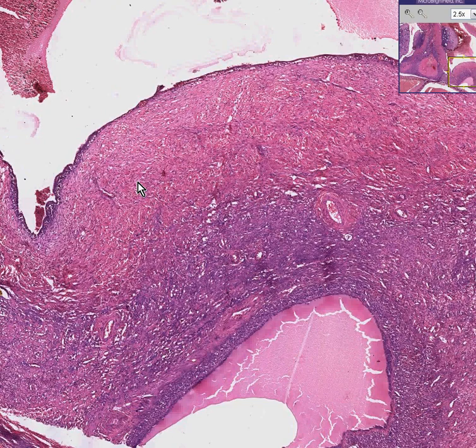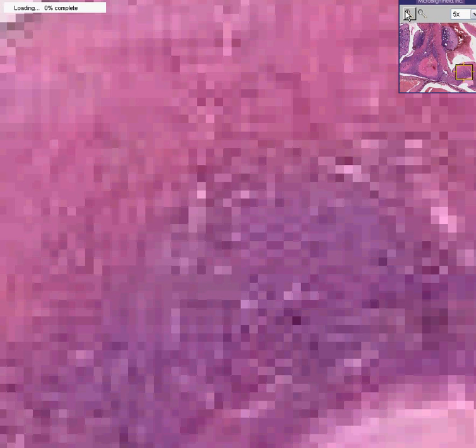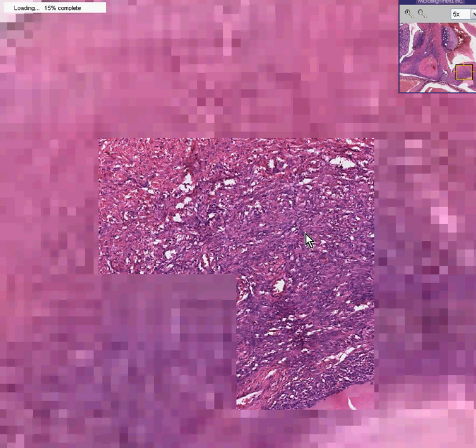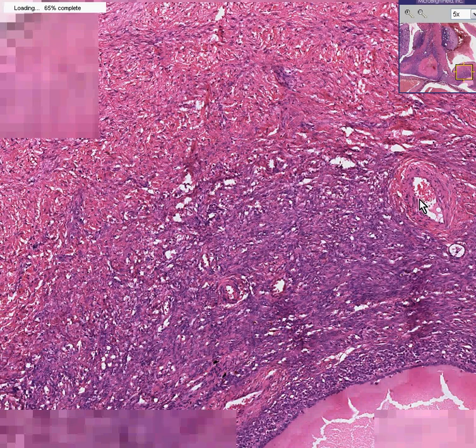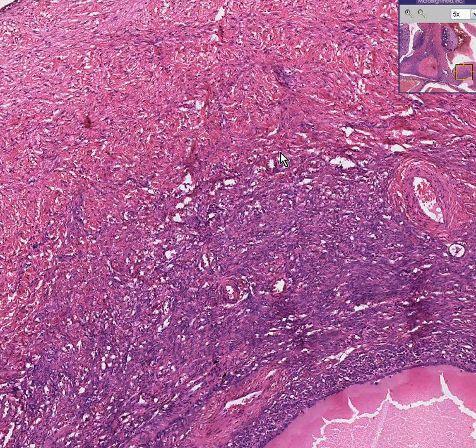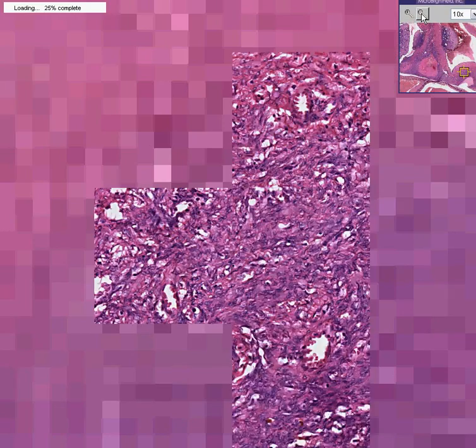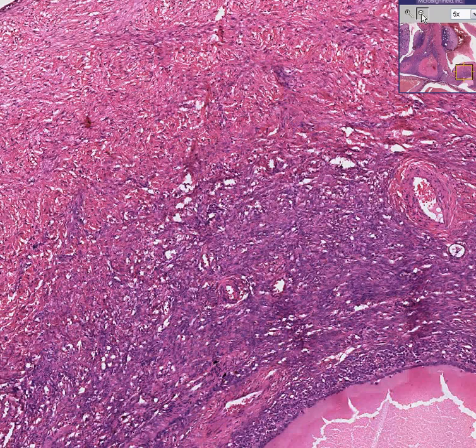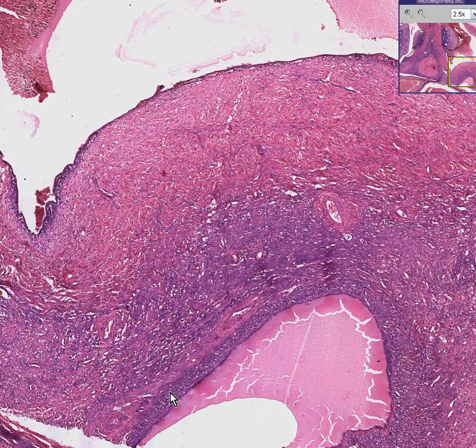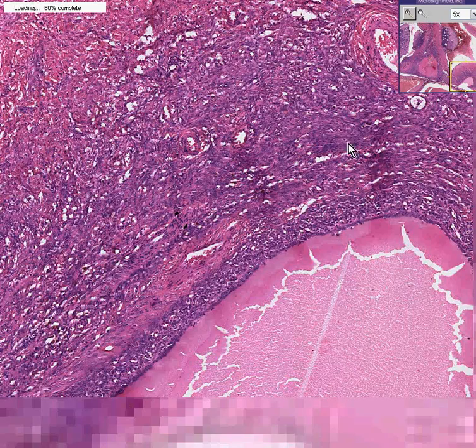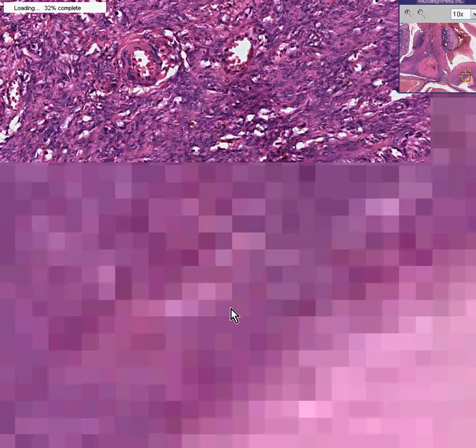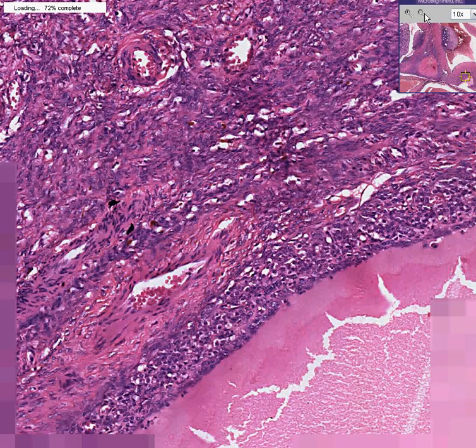Here is another ovary. These bluer cells look like classical ovarian stromal cells. You can also see areas that look more fibrous, and you can also see blood vessels. I don't think I'd have a hard time convincing you this was ovarian tissue. There's even what might be part of a little follicular cyst here, because it looks like it's lined by some epithelium — another reason why you'd totally believe this is ovary.